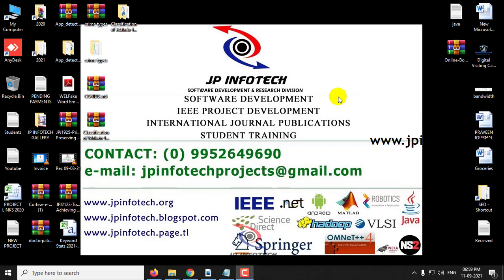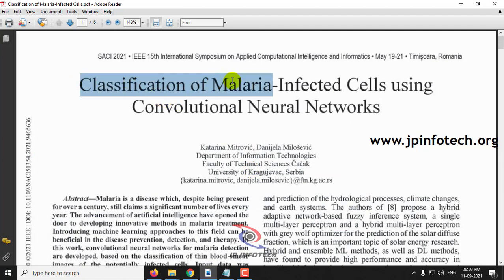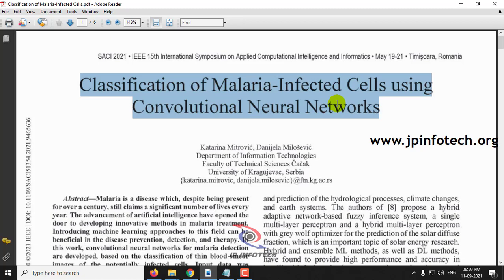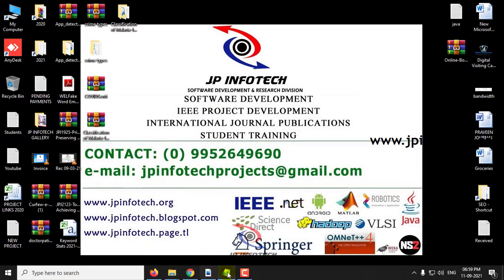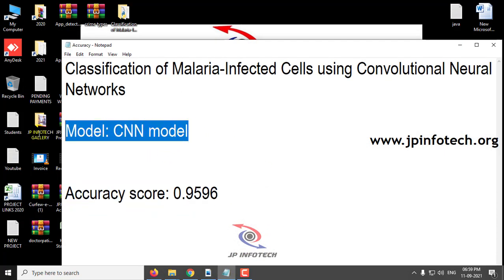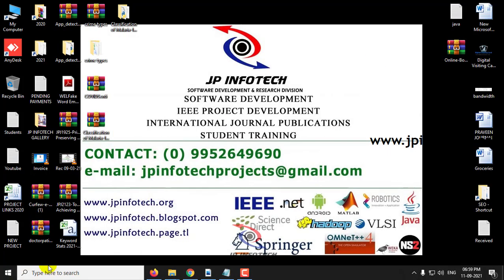In this video, we are going to see a Python project entitled Classification of Malaria Infected Cells Using Convolutional Neural Networks, which is an IEEE 2021 conference paper. We have implemented this using the CNN model and the accuracy score is 0.9596, which is around 96%. Now let us see the execution of the project.